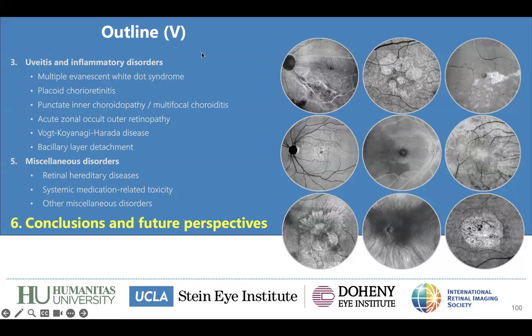We usually use the Solix here at UCLA with Dr. Saraf, so I have more experience with that, and I think it's great. I also know that Plex Elite is great. Dr. Freund, for example, in New York uses that. There are so many different devices, and each of them has advantages and disadvantages, especially in terms of time-consuming nature. I think the most important points with the different devices are also the ultra wide field capability and segmentation artifacts.